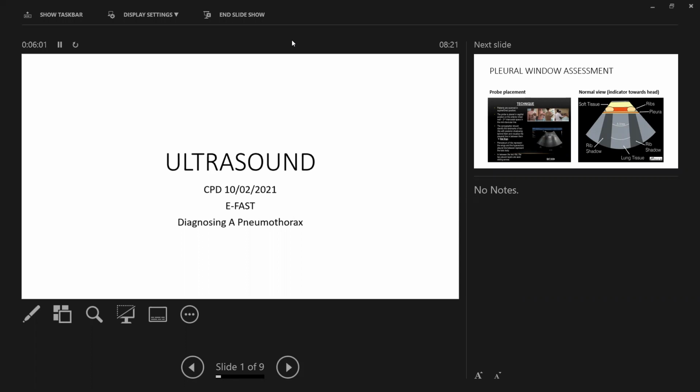Yeah, okay. All right, so like I was saying, today we're going to talk about the ultrasound and how we use it to diagnose a pneumothorax and EFAS, not how to diagnose an EFAS. Sorry. So, like I say, traditionally, pneumothorax was something that you diagnose clinically. That means you see a sucking wound, you feel surgical emphysema, things like that. Otherwise it was X-ray, and that was it.